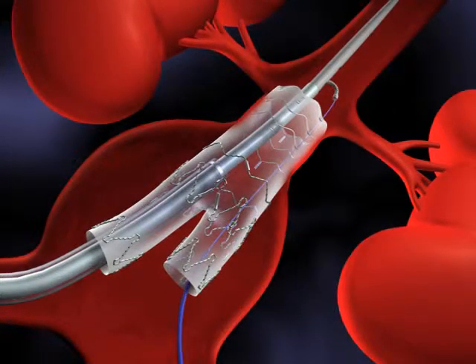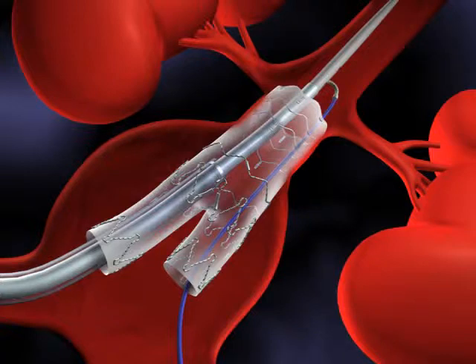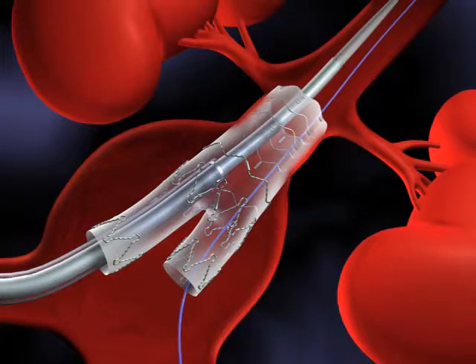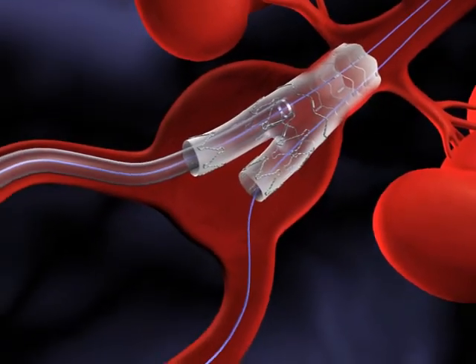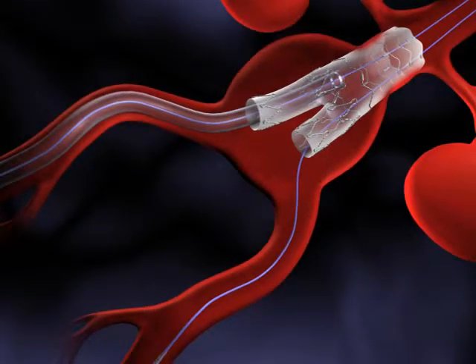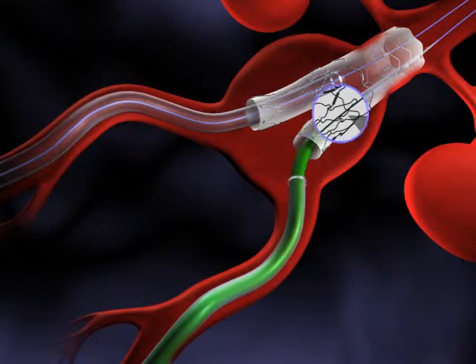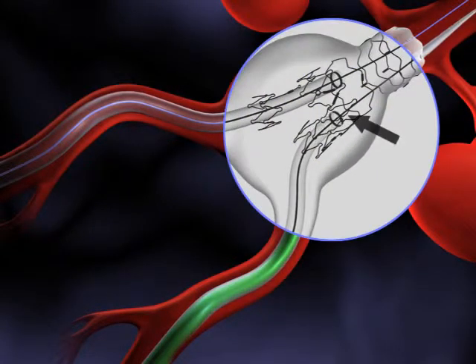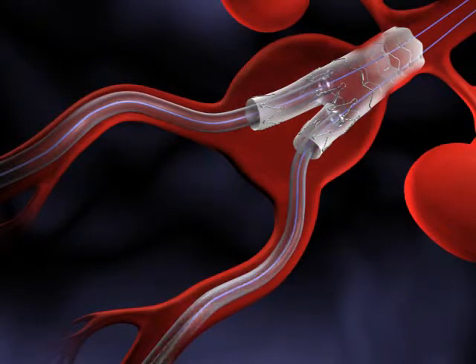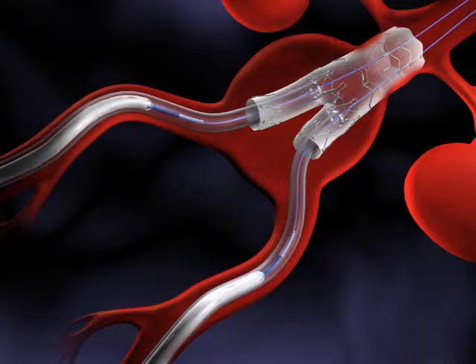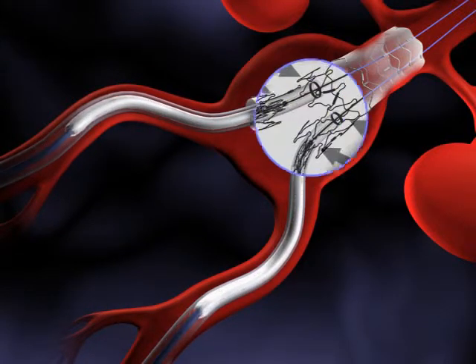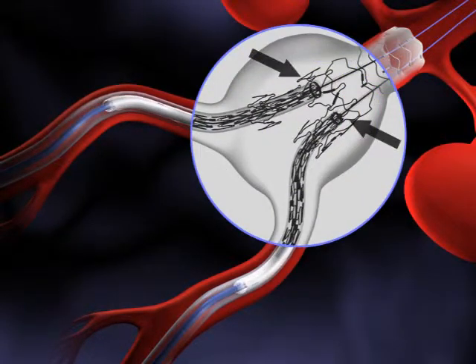Once in position, the guide wire is retrieved from the femoral artery, followed by a guide wire exchange and removal of the directional catheter. The contralateral introducer sheath with dilator is then advanced until the radiopaque sheath marker is level with the graft bifurcation. The dilator is removed.